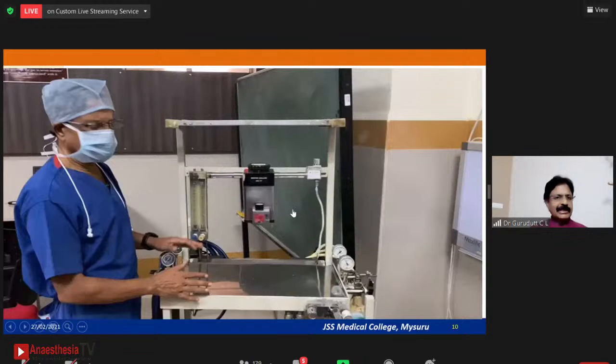So now we can just go with the master-slave mechanism. Just look at this video and you will know how to tell whether the master-slave mechanism is there and whether the fail-safe system is really fail-safe or not.